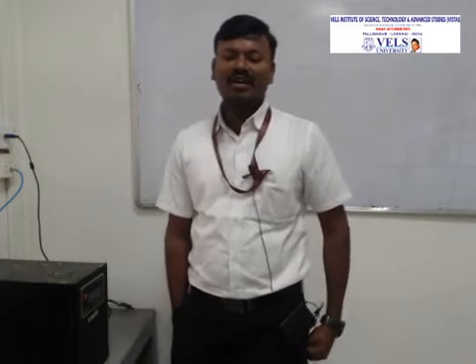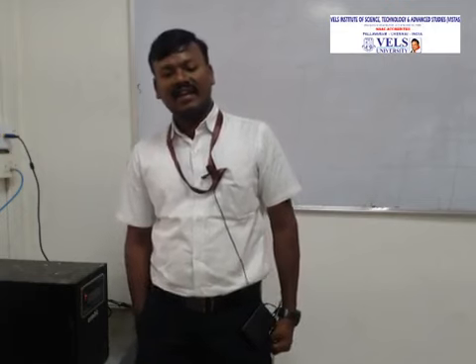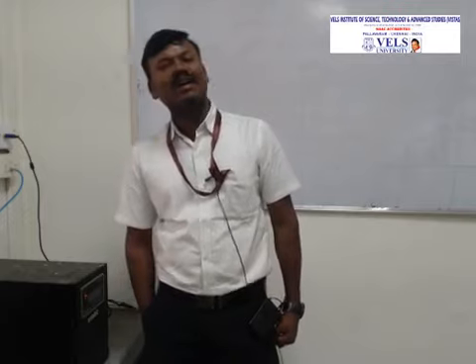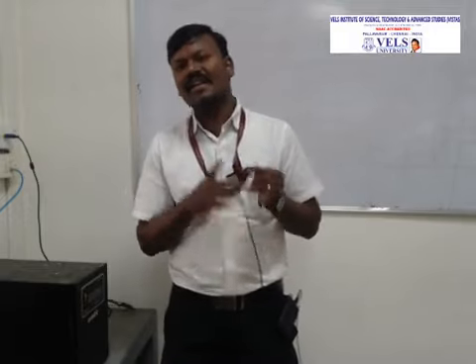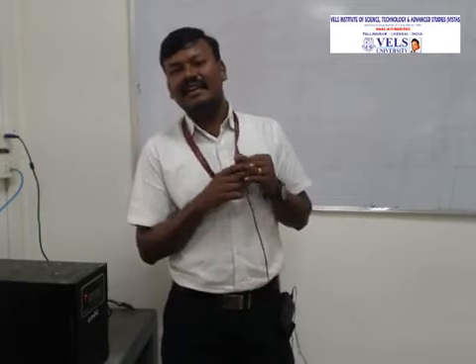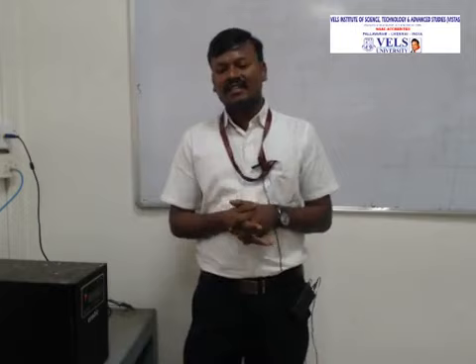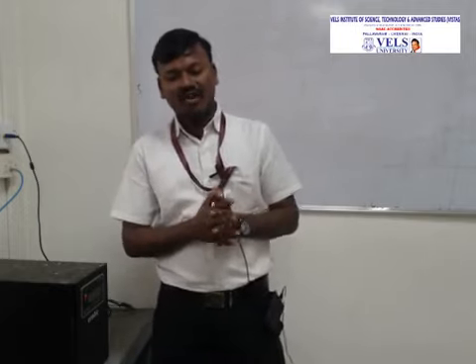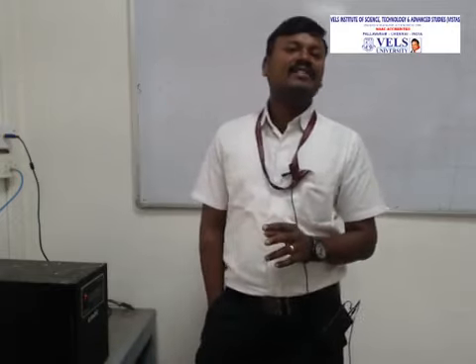Here, contact lasers or non-contact lasers can be used. For both we can use. In the case of a contact laser, radiation has to be delivered directly to the zona. See, there are two things: contact laser and non-contact laser. In the case of a contact laser, it has direct contact with the zona pellucida. But in the case of a non-contact laser, used in gamete manipulation as described, there is no contact with the zona. It is done using various wavelengths.